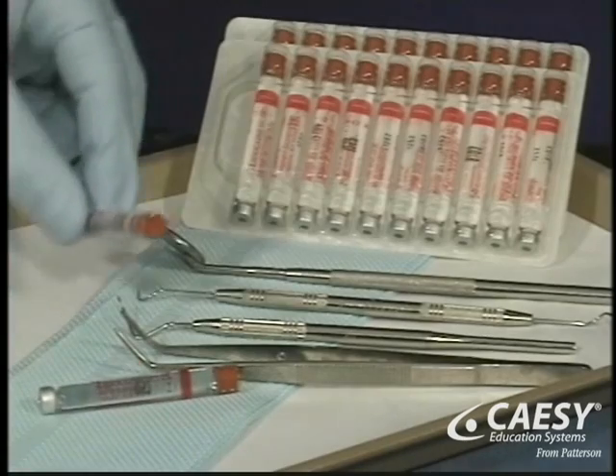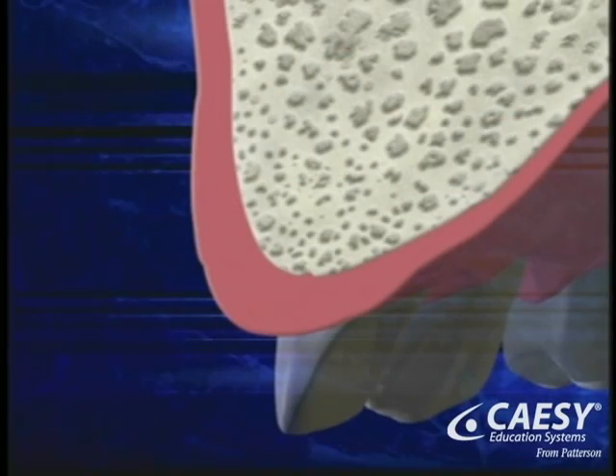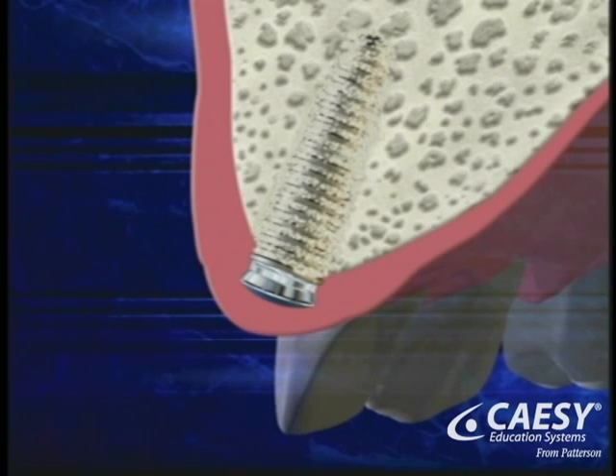For the surgical placement of the implant, your mouth will be numbed. An incision is made in your gums and a channel is made in the bone to receive the implant. After the implant is snugly in place, the gums are closed over the implant with a stitch or two. Over the course of the next few months, the implant becomes securely attached to the bone.